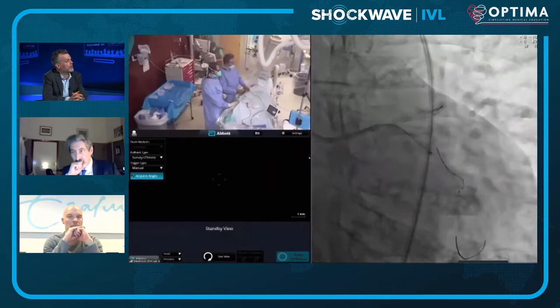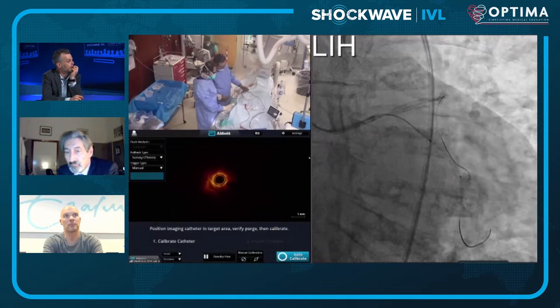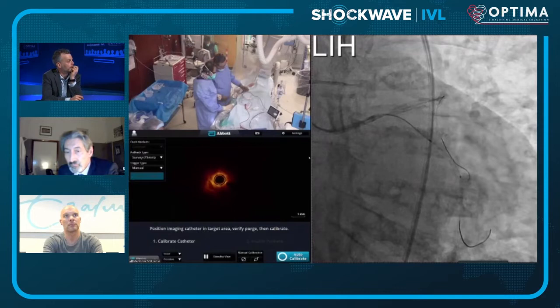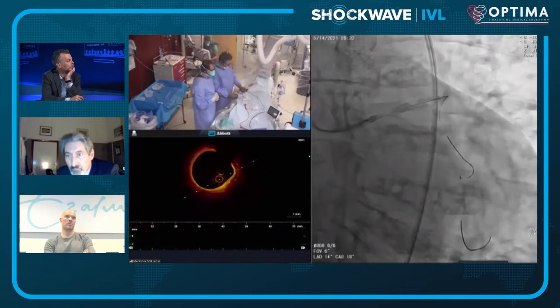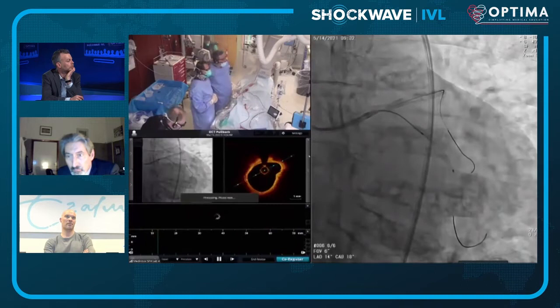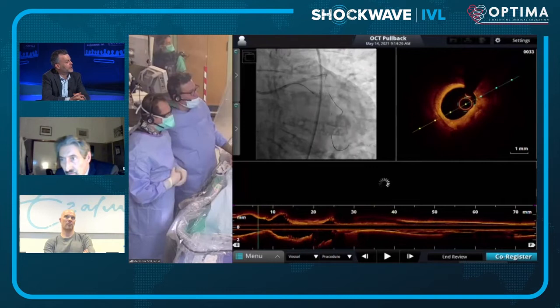Richard proceeds to OCT using a new catheter, noting the new software is quite impressive. He always does a manual pullback. The team runs OCT and James puts Carlo in charge of OCT commentary. Carlo notes there was a bit of blood near the guide at the end of the run, but the plaque has been reasonably well shown — you can see through the lesion, the calcium, and into the guide.